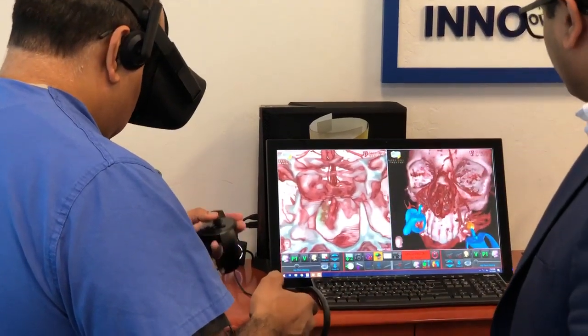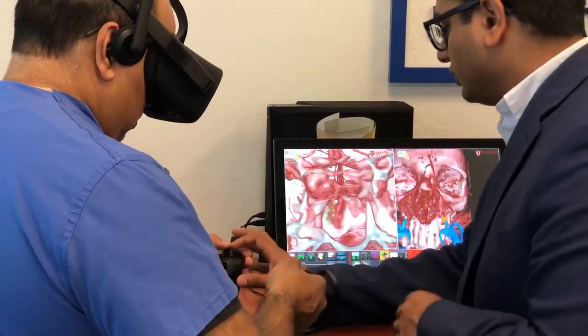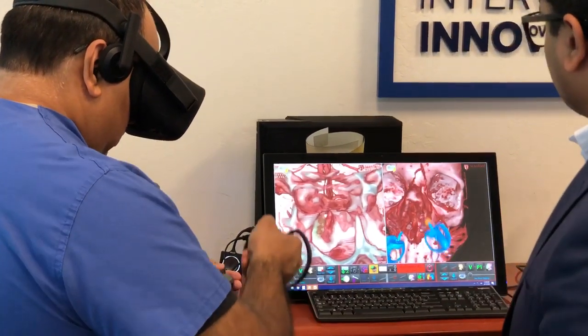Now look at your right hand — you see that little orange thing? Now get in close to the bone, so zoom in with your left joystick and get close to the bone.